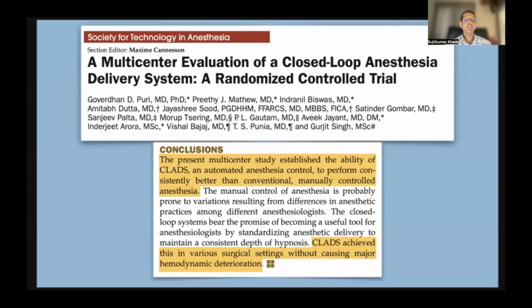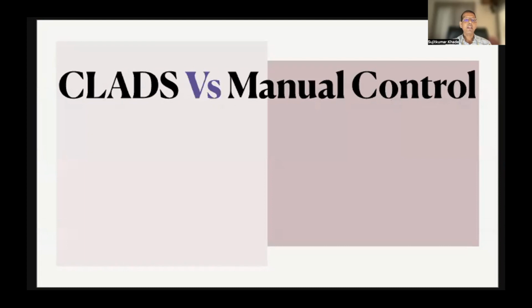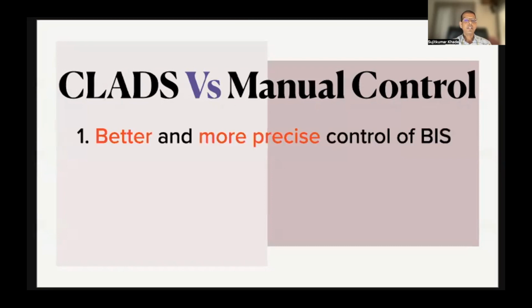CLADS achieved this in various surgical settings without causing major hemodynamic deterioration. CLADS versus manual control: the closed loop controlled anesthesia has a better and more precise control of BIS than the conventional manual control of propofol dose delivery. The wobble, which depicts the intra-individual variability, was less, which reflects the yo-yo effect in performance of the system.